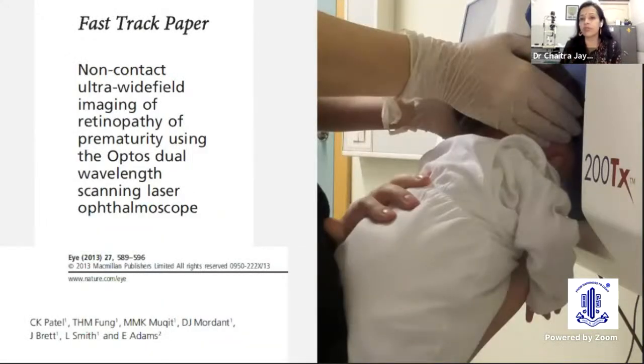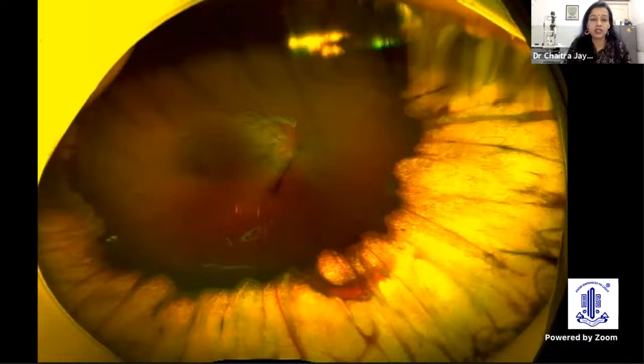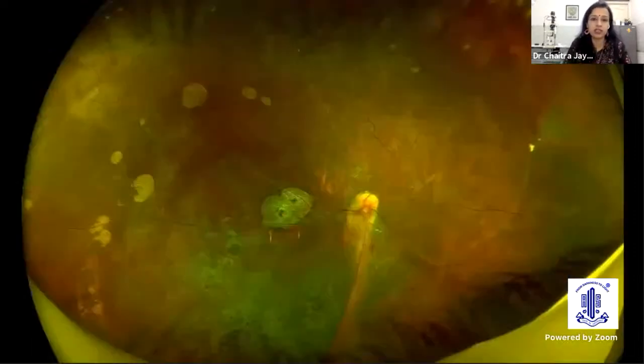This is one of the earliest publications of Optos in 2013 itself, where a flying baby position needs to be adopted, and it can still be done with rabbits. You can definitely do it with children. And here you can see these congenital anomalies. This is an unusual case where we saw gyrate-like atrophy again in a young child.